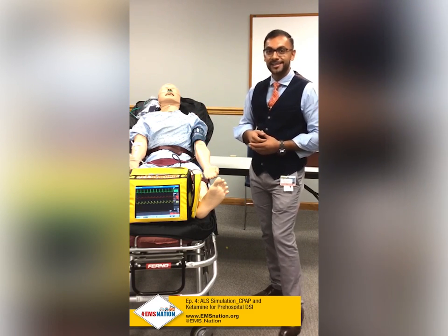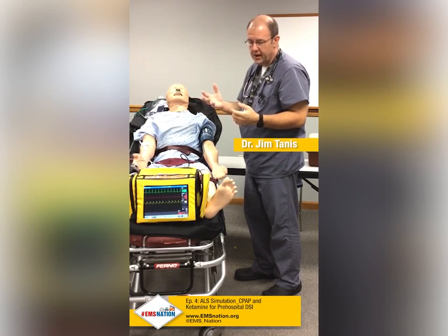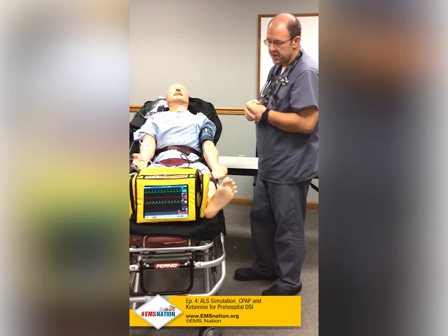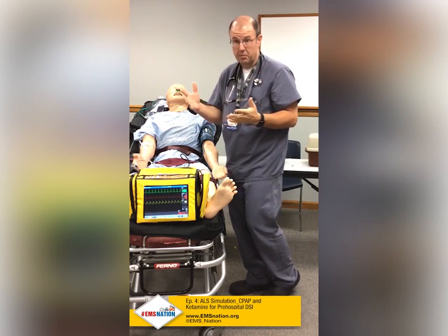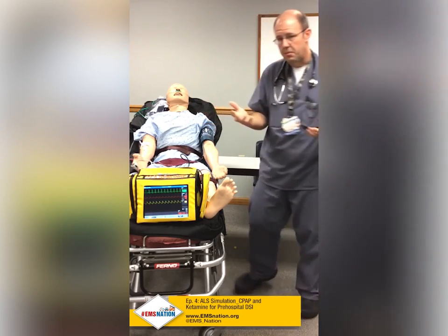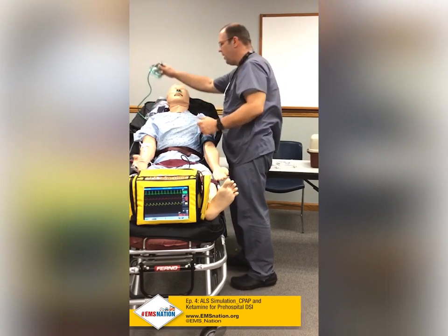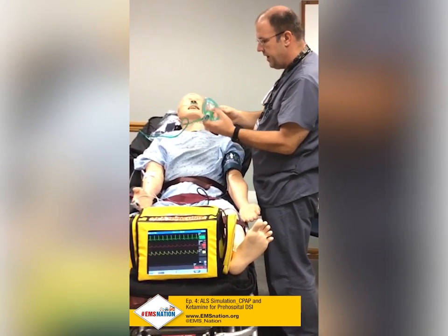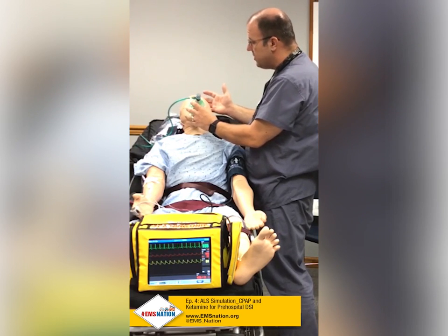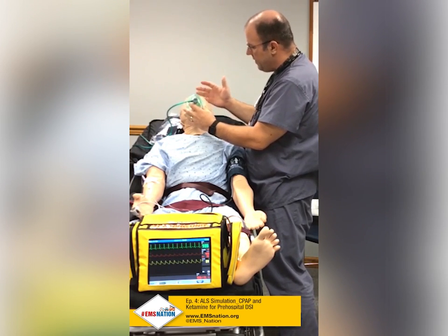Our patient is still hypoxic despite high-flow oxygen. We need to recruit alveoli and apply PEEP to overcome the V/Q mismatch. The patient won't tolerate the CPAP mask. This version runs on standard oxygen tubing turned up to 15 liters per minute and provides 10 cmH2O of PEEP. If the patient is agitated, we can try talking to and reassuring them that we're here to help, not to suffocate them.